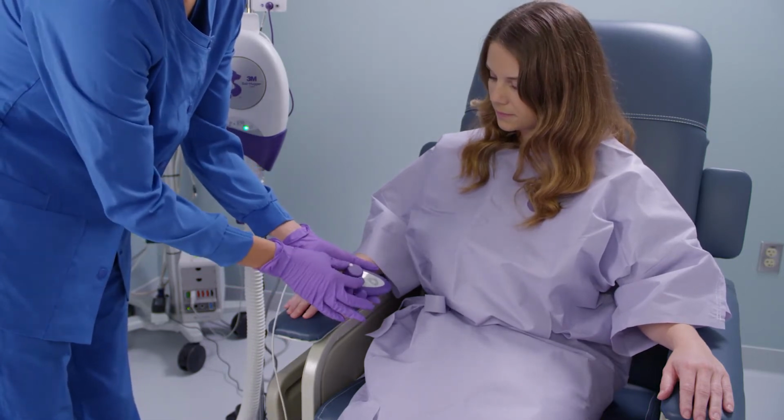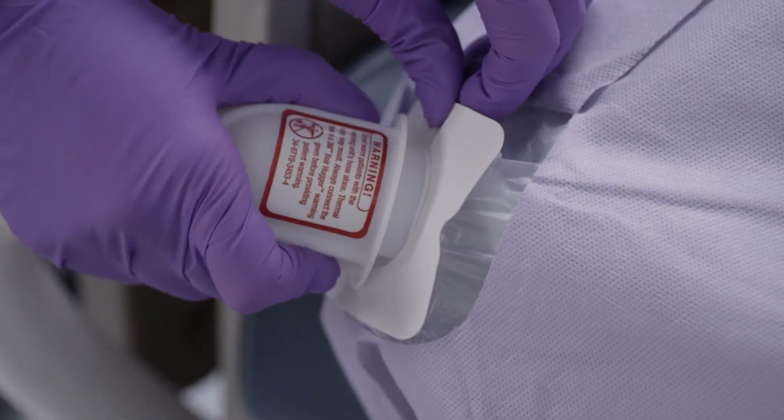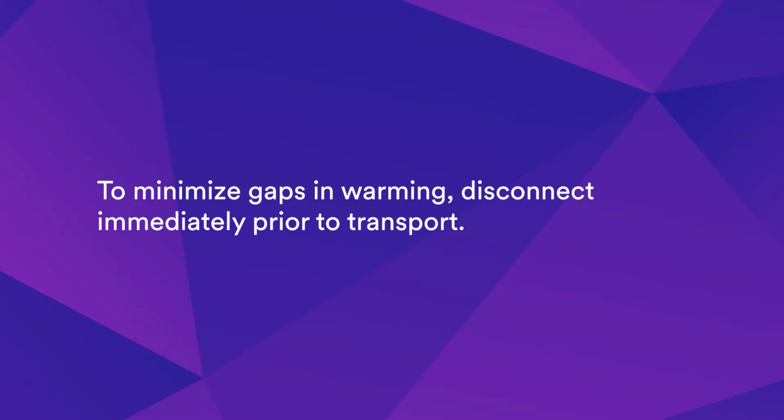candidates for pre-warming. Turn the knob on the handheld temperature controller counterclockwise until it clicks to discontinue warming therapy. Then disconnect the hose from the gown. To minimize gaps in warming, disconnect immediately prior to transport.